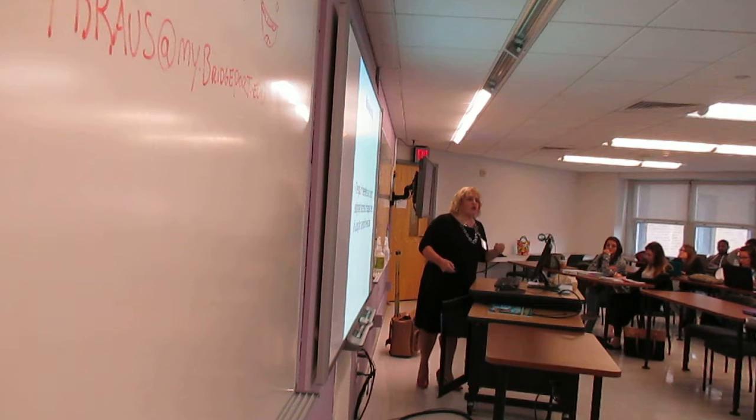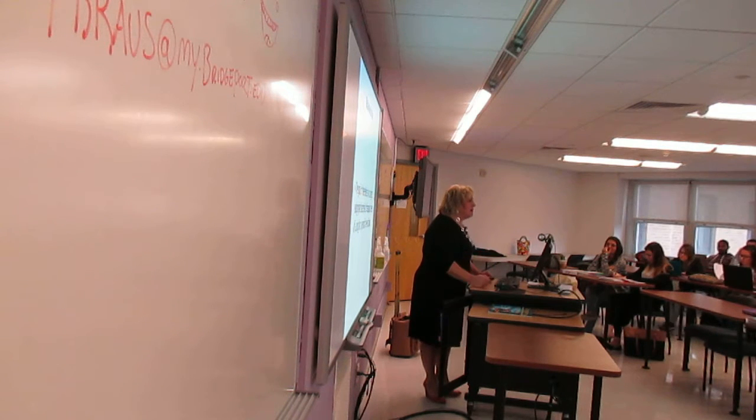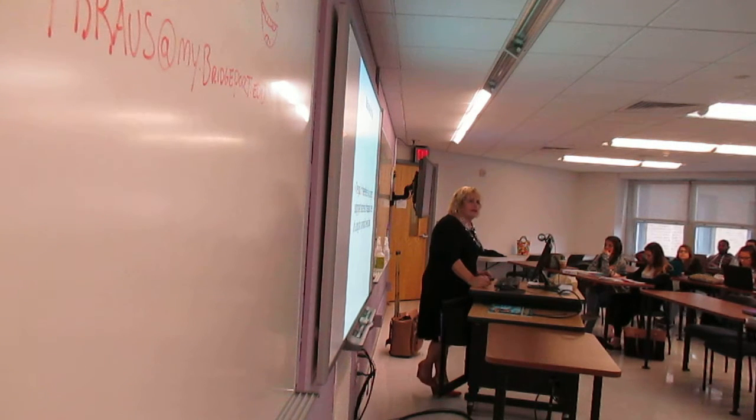Yes. And what's the minimum amount of pocket depth you would want to put any of these in? 5 millimeters or more.